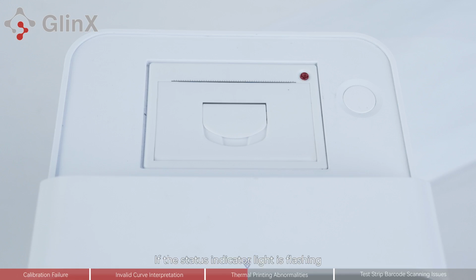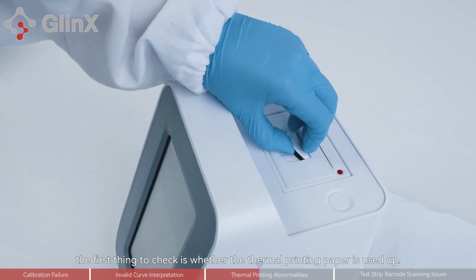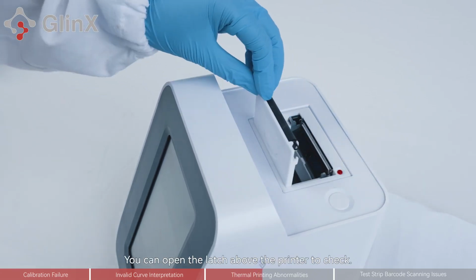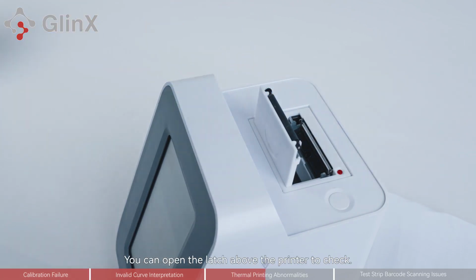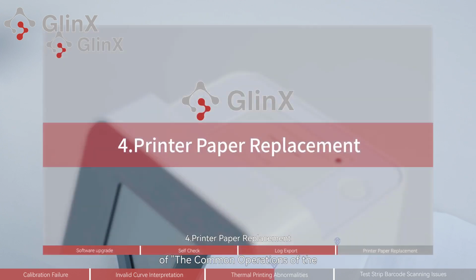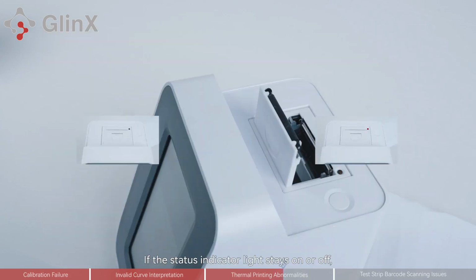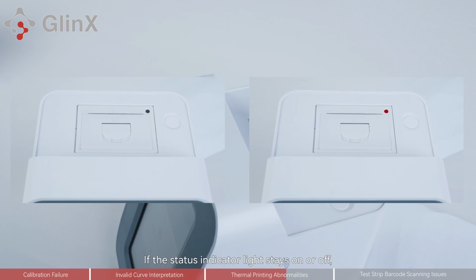If the status indicator light is flashing 3 times at a fast pace or stays on, but printing fails, the first thing to check is whether the thermal printing paper is used up. You can open the latch above the printer to check. For detailed instructions, refer to the Printer Paper Replacement section of the Common Operations of the FiDX Fluorescent Immunoassay Analyzer video. 2. Printer malfunction.